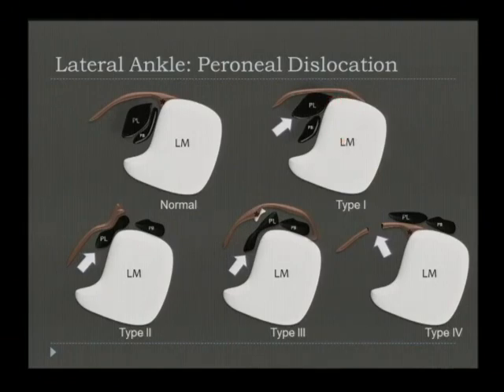I will say that transducer pressure is important. You do not want to be pushing very hard at this time because you want to allow these tendons to sublux. You could actually hold them in place while doing this maneuver, so you want to really use quite a large amount of gel when doing this.